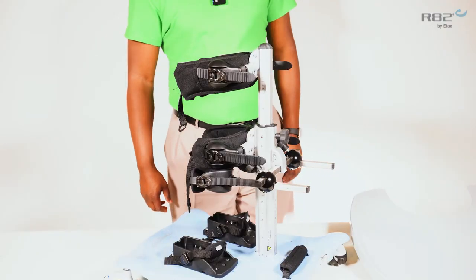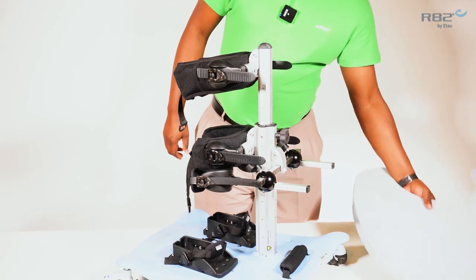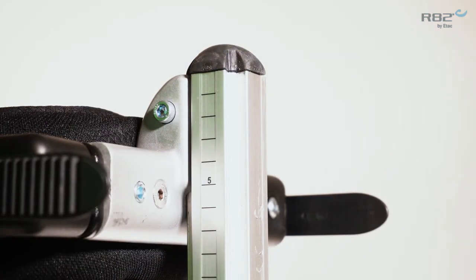Once your Meerkat is set up for anterior use, you're able to use the tray. The tray mounts onto the height adjustable column in front of the chest support.